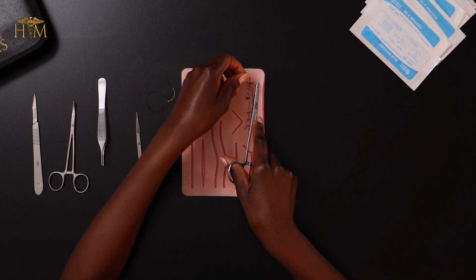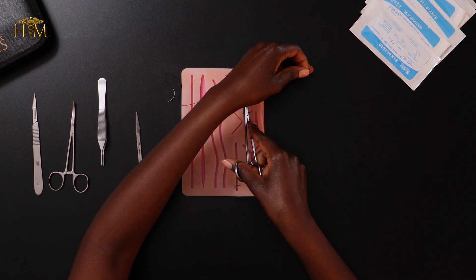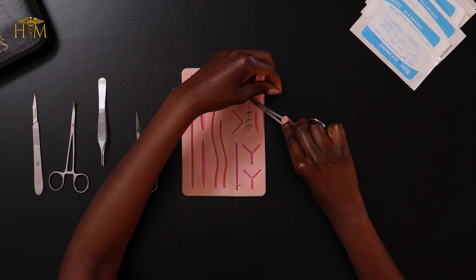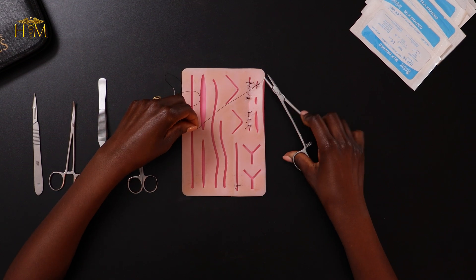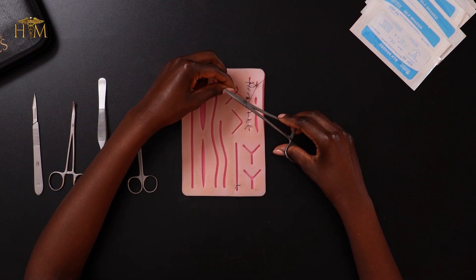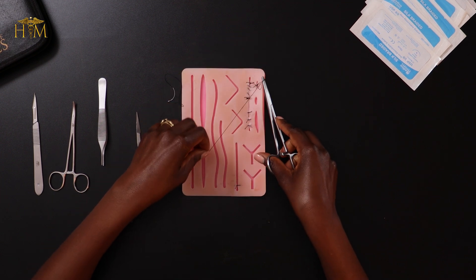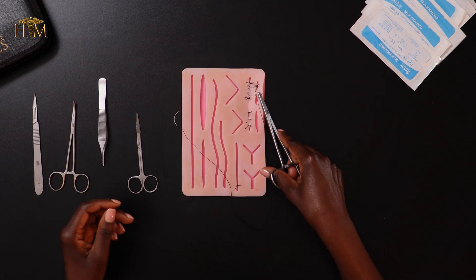The tie is exactly the same — we're going to do an instrument tie. Wrap the suture around the needle holder twice, grab the short end of the suture, pull whilst crossing my hands over, then again around the other way, grab the suture and pull, and then once more in the opposite direction — wrap around once, grab the suture and pull whilst crossing my hands over. And as you can see this has left you with a nice cross, what we call a figure of eight suture.